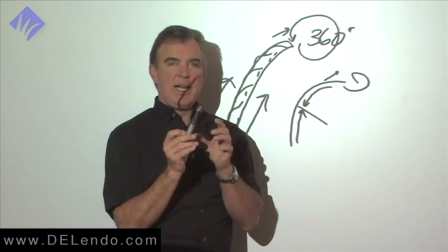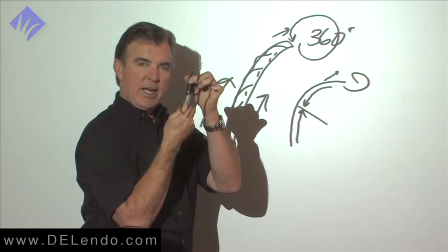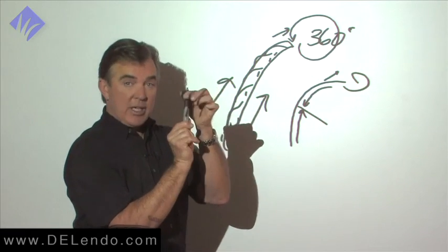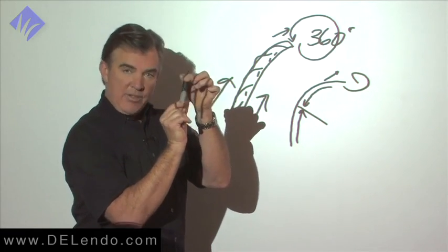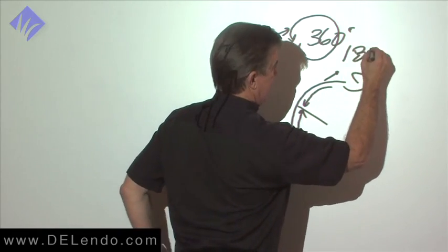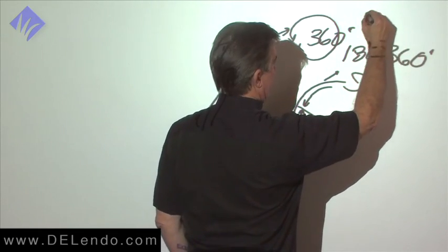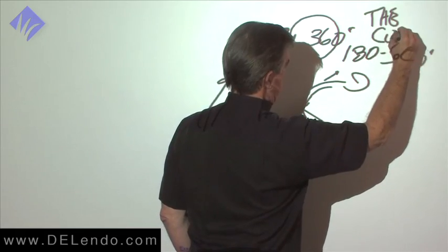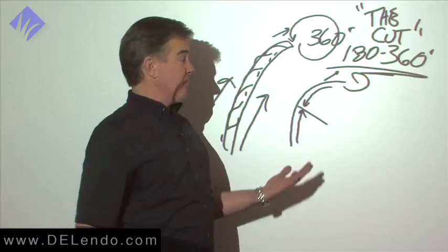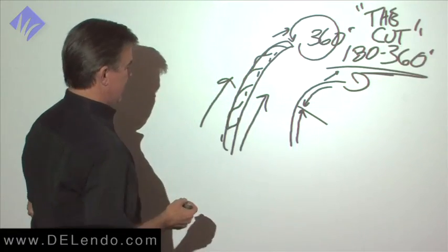When you thread the blade in, and you reset your hands, put a good apical force on it, and start rotating, you'll feel it get tighter and tighter and tighter until it gives a little bit and you feel a click, and then it gives again and you feel a second click, and then it's smooth. Usually that occurs between 180 and 360. Okay, and that's the cut. If you rotate less than 180 degrees, it's not going to cut. You're just going to wind it, and then it's going to spring back to its original position.